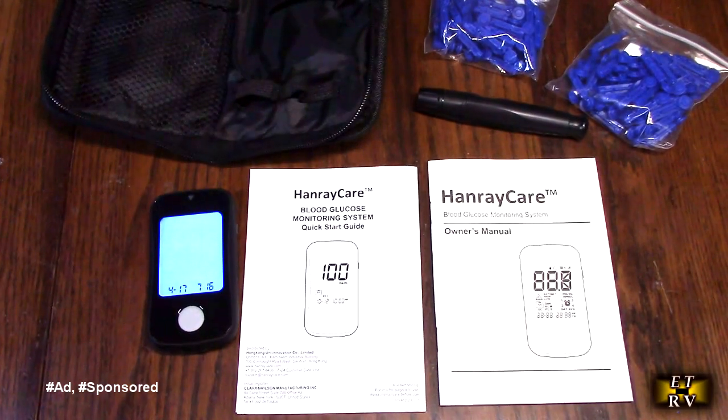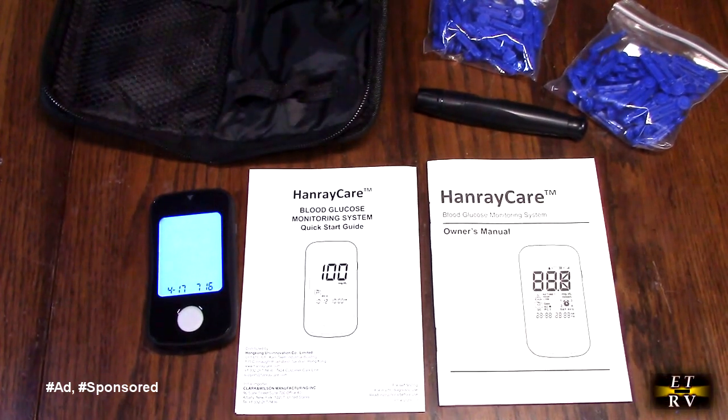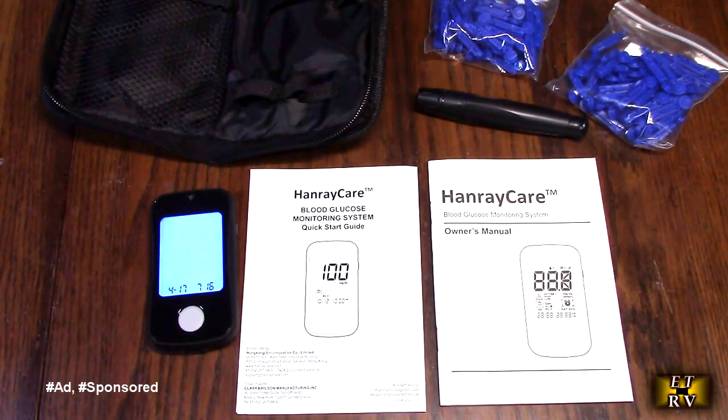Hello again. This is Robert Veach here. This is my video review of the HanrayCare.